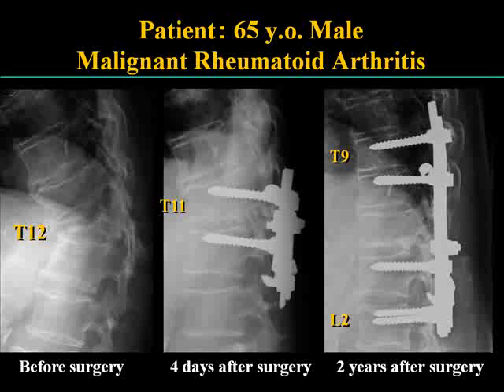In this case, at the first surgery, I mistakenly removed the interspinous ligament between T11 and T12. Preservation of posterior ligamentous complex is very important to prevent the chance fracture of the upper adjacent vertebral body.